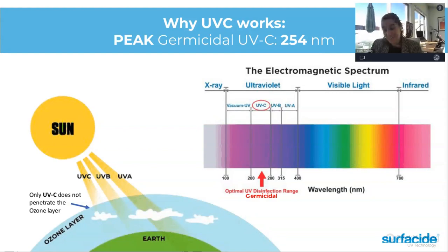Their HVAC really is for maintaining the temperature of your space. It is not for purifying the air. While it does have some germicidal effect, it is not going to be at the level that you want it to be.